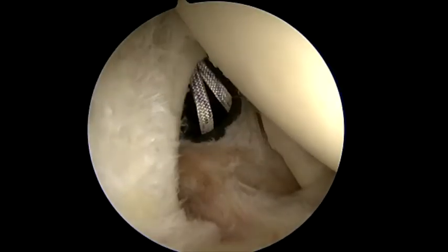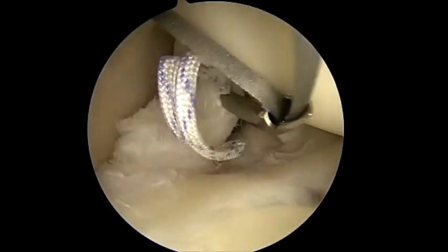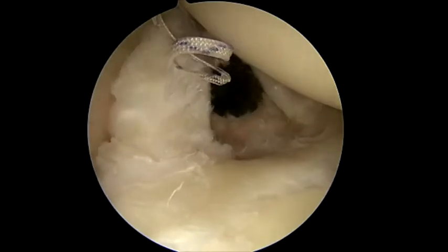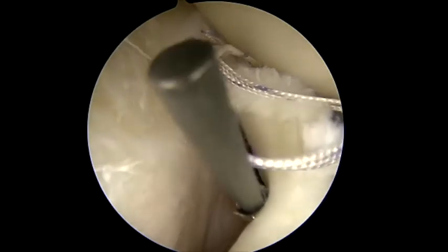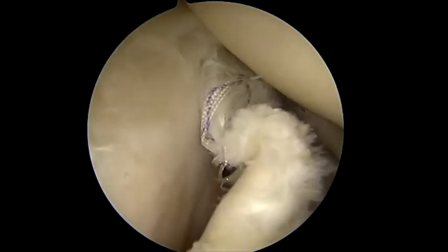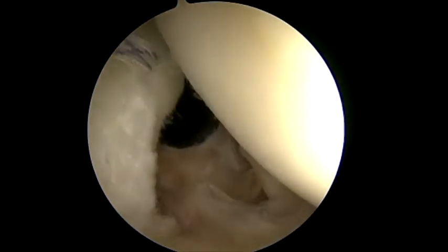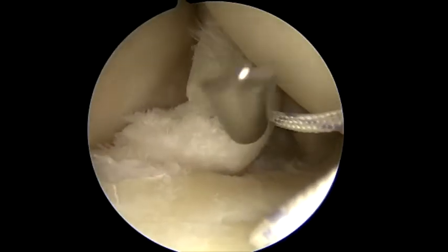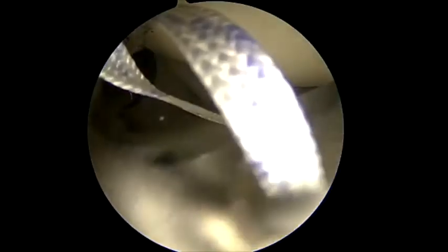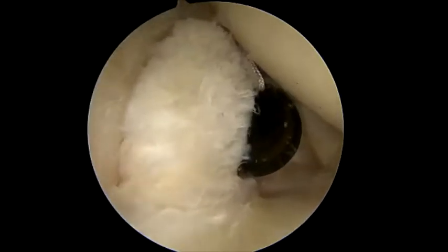This is the right shoulder in the lateral position, viewed from posterior. We penetrate the biceps using a suturing device called the slingshot, which allows you to hold a fairly good length of suture within the device itself to leave a longer tail to retrieve once it's deployed. The middle of the suture is then retrieved through the anterior portal, and the sutures are luggage tagged onto themselves around the biceps. I take one of the free limbs and penetrate the tendon again for an additional point of fixation, placing it more distal than the previous point, and go around the tendon in the opposite direction to loop the other half of the tendon with the suture.